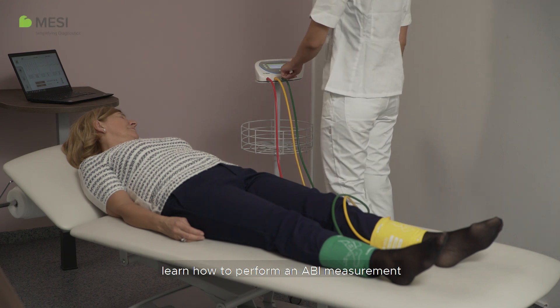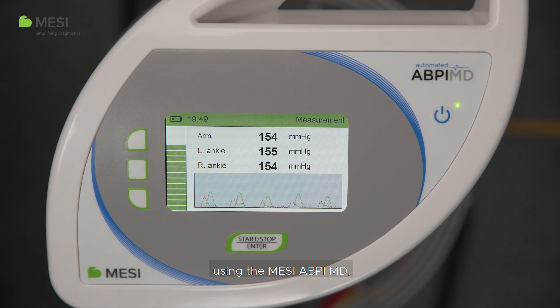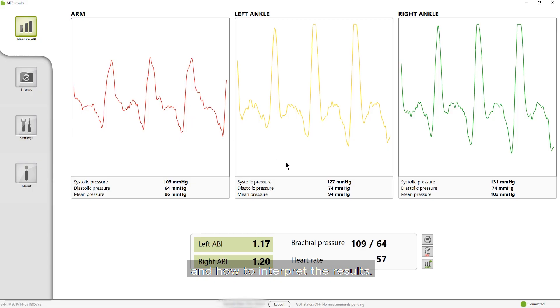In the following video, learn how to perform an ABI measurement using the MESI ABPI-MD, how to place the cuffs correctly, and how to interpret the results.